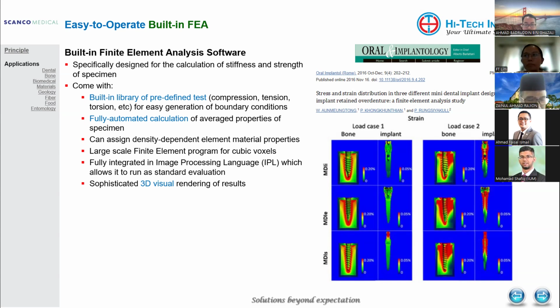But just one thing, the FOV, the field of view. When you talk about scanning a fossil, all these things, it can include all those structures, a skeleton of the animal. What's the maximum size you have for your FOV? For ScanCo, we have three different ranges: one for ex vivo, one for in vivo, and one for human.